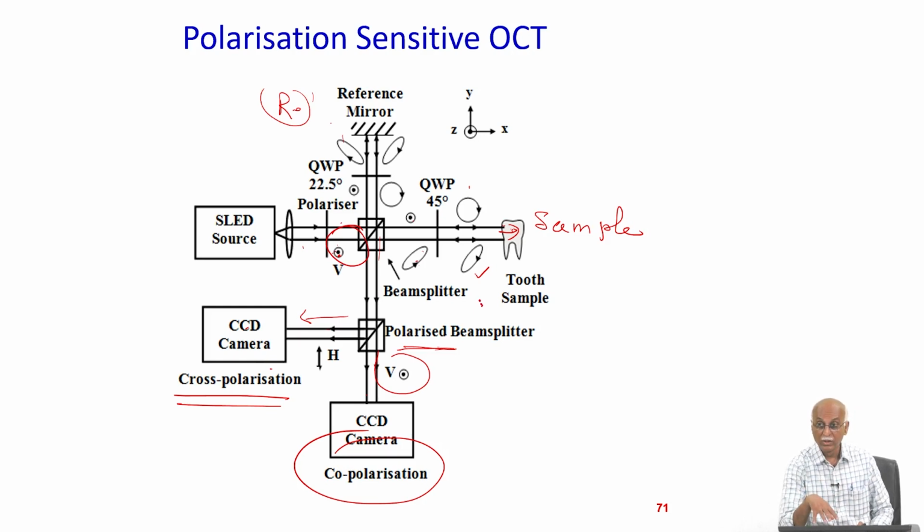So, you can think that if I want to make this compact and useful for certain applications, particularly dermatology applications, or applications where birefringence characteristics are present, I have to convert this into an optical fiber based system, so as to make it easy and flexible, so you can easily move it. You do not have to worry about alignment, because optical fibers will ensure that the light propagates through the medium and can change direction easily.